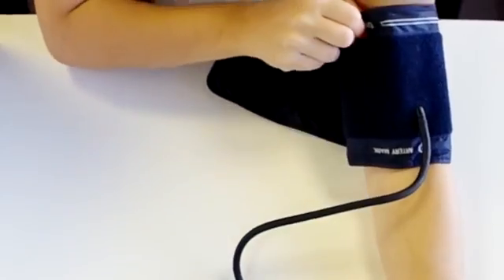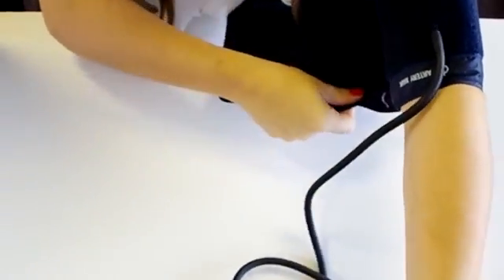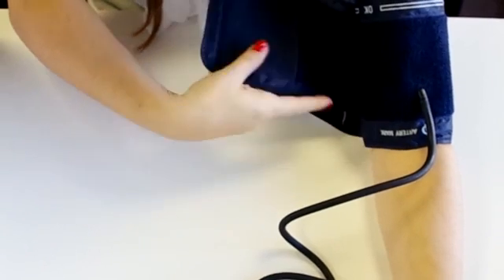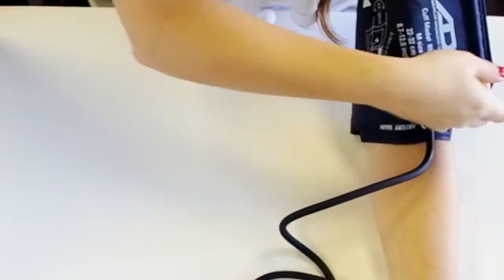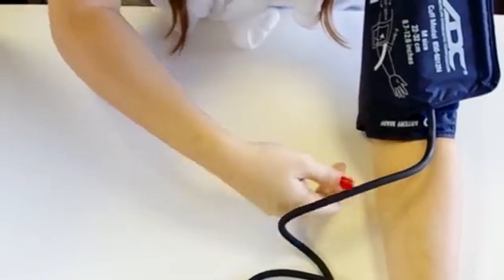Put the cuff on your upper arm about one inch, or two to three centimeters, above the elbow crease. Each ADC cuff is labeled with an artery mark. This mark should align with the artery that runs down the center of your arm. The cuff should be just tight enough that you can fit two fingers under the edge.